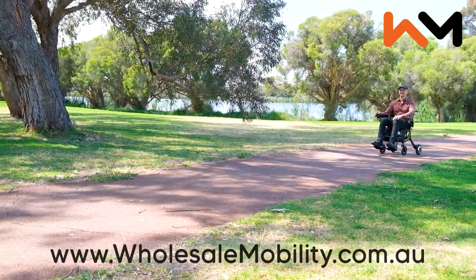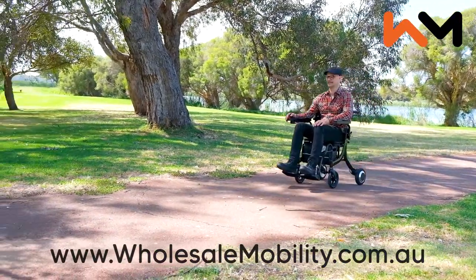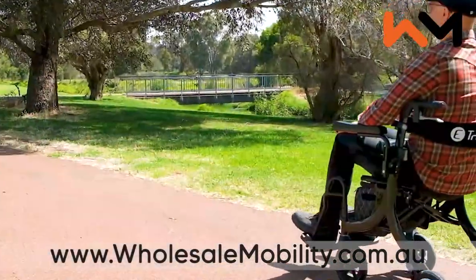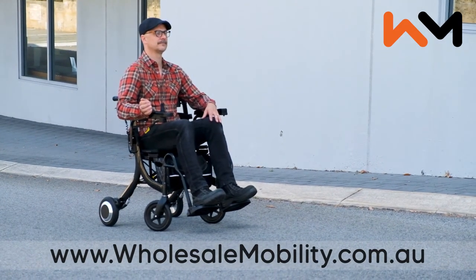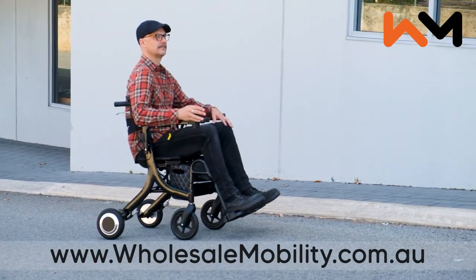Of course, the user can choose to operate the Evo themselves by turning on the joystick controller and having full independence of their travels. No matter if you use the Evo as a push assist manual wheelchair, electric wheelchair or electric rollator, it is packed with features ensuring comfort, convenience and easy usability.